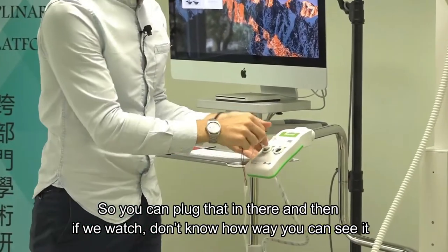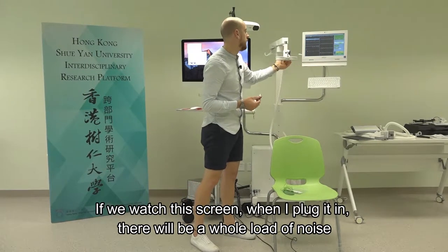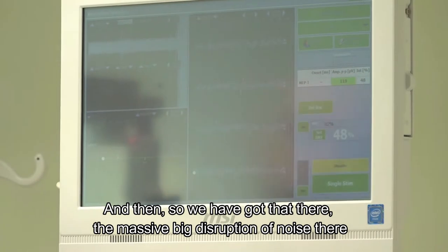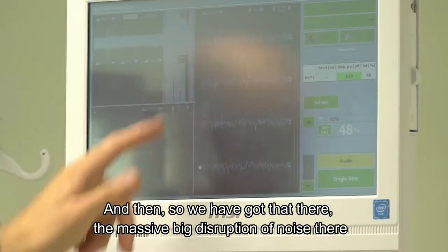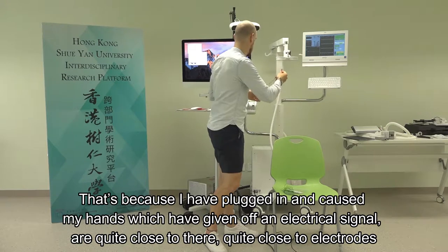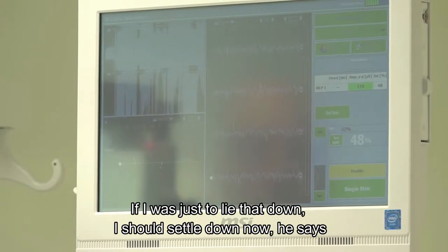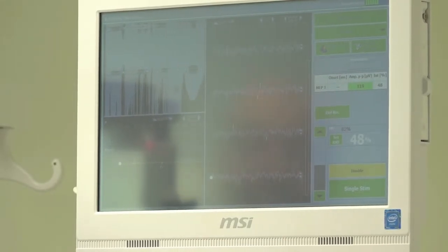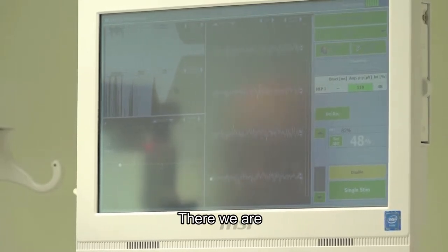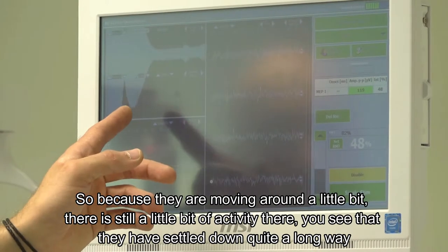You can plug the lead in, and when you plug it in there'll be a whole load of noise, because hands give off an electrical signal and are close to the electrodes. If you lay the lead down, that should settle. There is still a little bit of activity as the electrodes move around, but you can see they've settled down quite a long way.